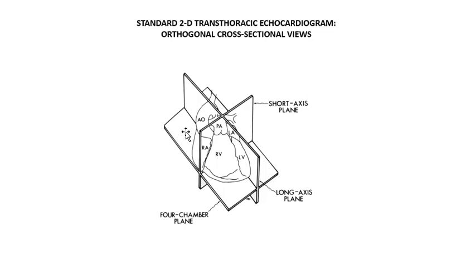It has two vertical planes, the short axis and the long axis plane, and a third horizontal four-chamber plane that bisects the heart horizontally. From that, you can obtain your standard echo images, which still takes a lot of understanding and a lot of practice. It's important to retain our frames of reference in that we still refer to anterior and posterior views. Just bear that in mind as we proceed because it has relevance to the angiographic planes that we see in the cath lab, because we look at the heart from different angles altogether, even though we're viewing the heart from basically the same external perspective.